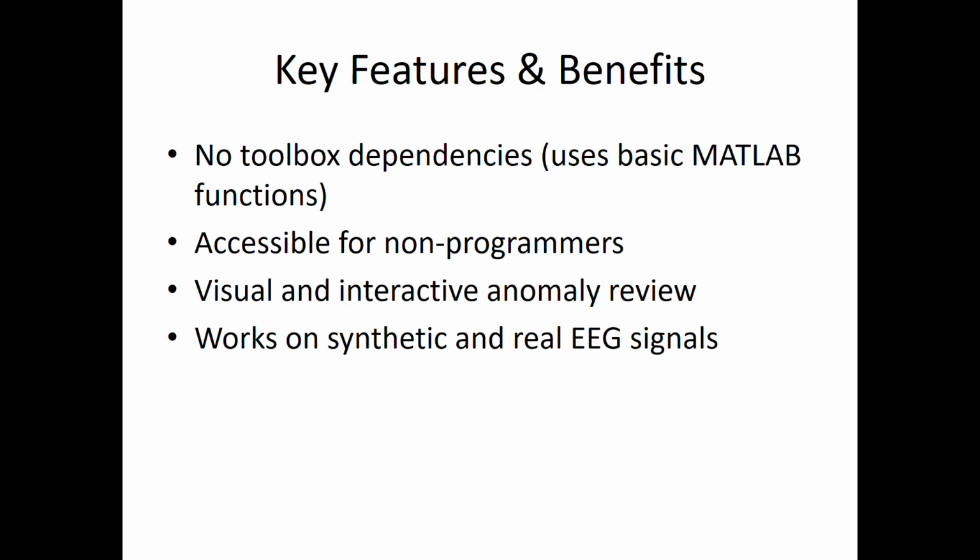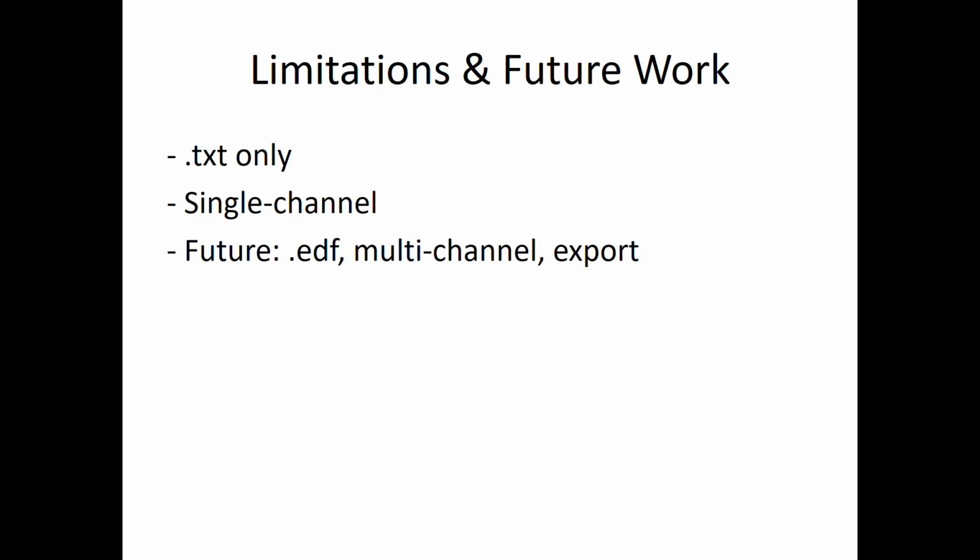In terms of benefits, the system is lightweight, easy to use, and doesn't rely on specialized toolboxes. It's especially useful in educational environments or introductory research contexts. However, there are some limitations. Currently, the system supports only single-channel TXT files. It doesn't yet support EDF files or multi-channel visualization.